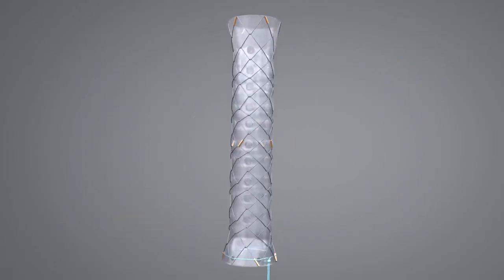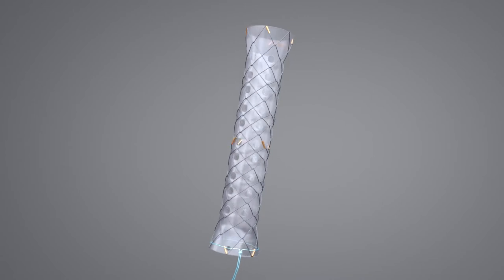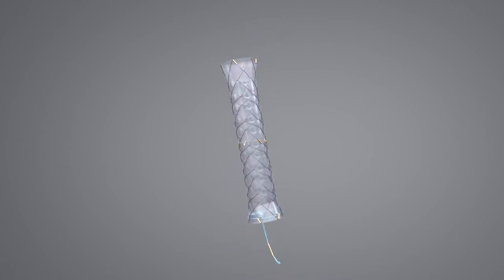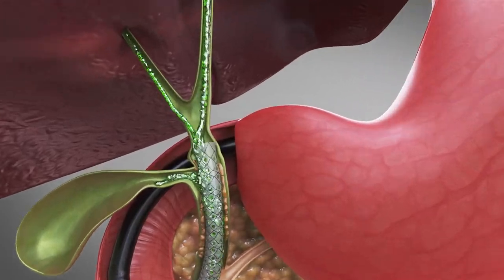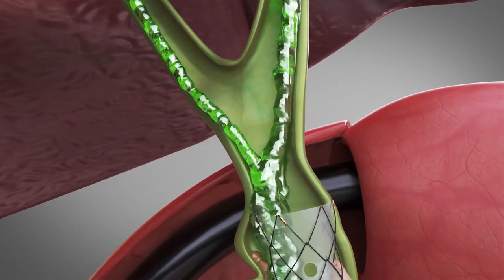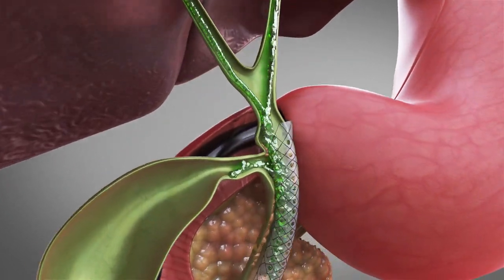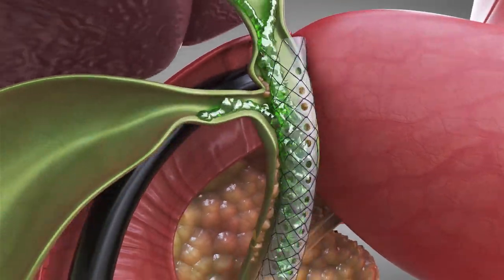Multi-hole biliary stent was created by combining the advantages of non-covered stent and fully covered stent. The multi-hole biliary stent assists with the bile drainage through the multiple holes of the silicone membrane, especially from the side branches of the biliary tree.